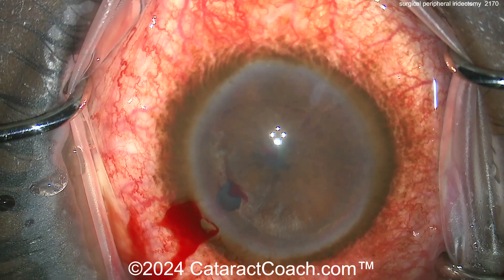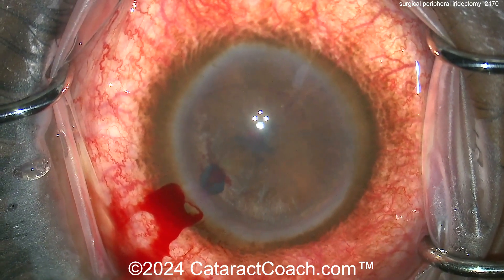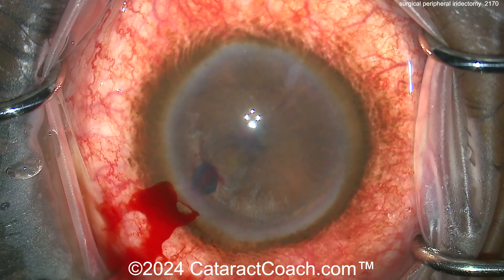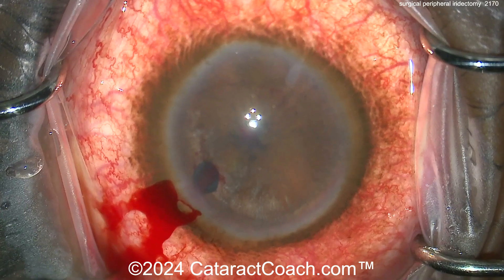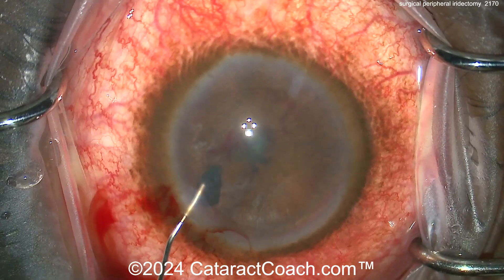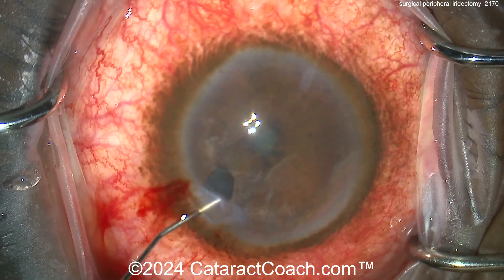Now look — it keeps expanding. The danger in this method is that you can make a hole a lot bigger than you're expecting. That's okay — it's certainly going to be patent and it's going to allow a good flow of aqueous. Eye pressure is pretty normal now. You can flush out any of the remaining viscoelastic that you put in there.